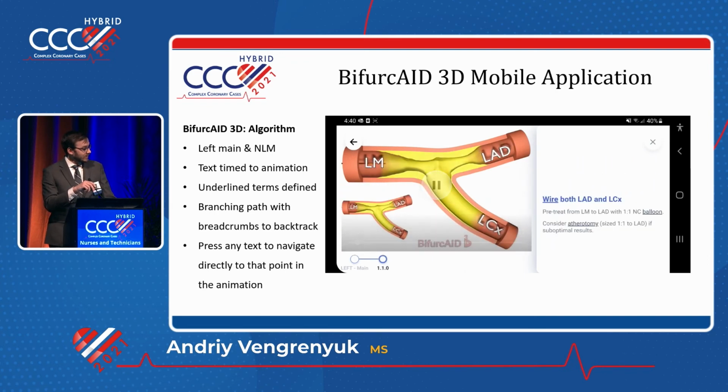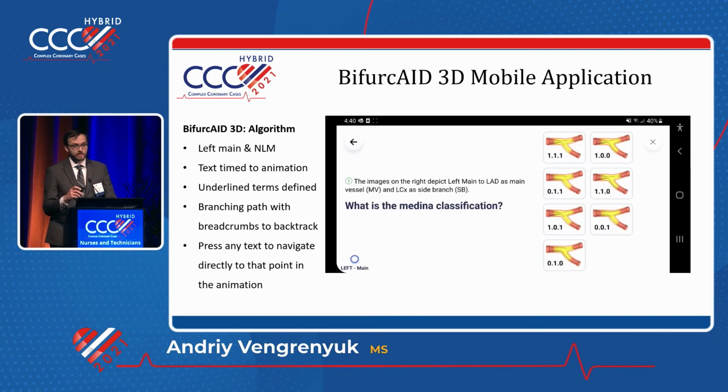Now we're moving backwards. Every one of these dots, if you click, it'll navigate you backwards to that point. So you can always explore how the treatment would be different if there wasn't plaque shift, or there was.